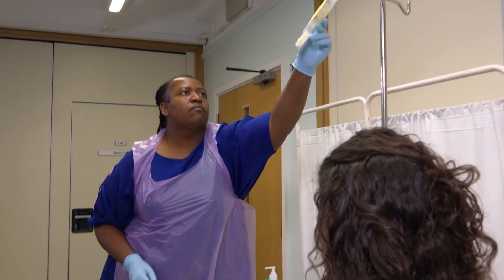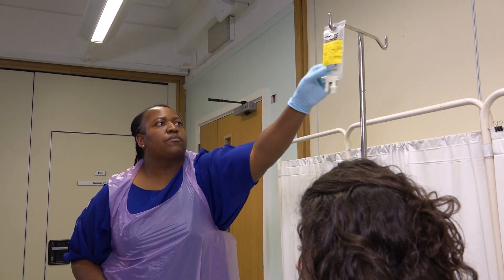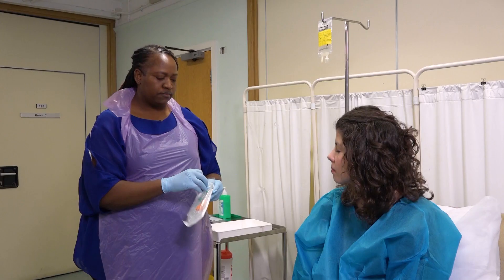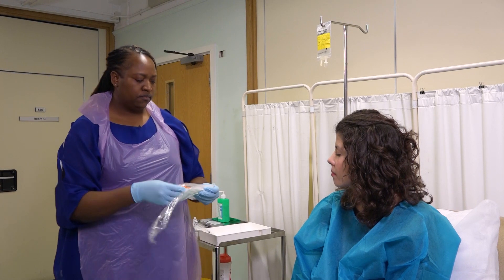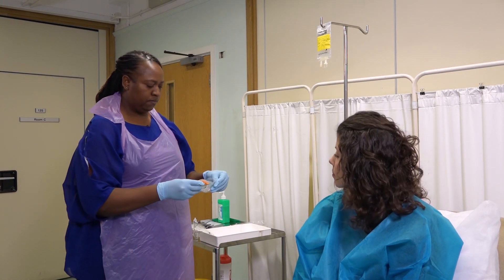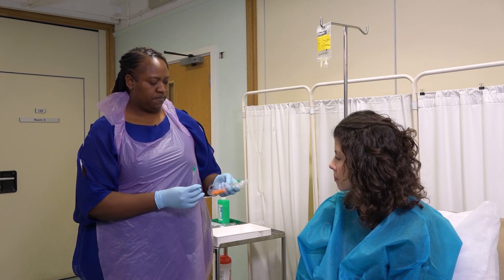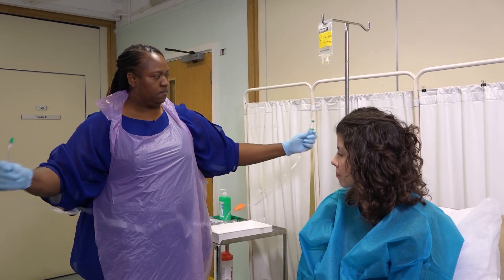Hang it on the drip stand. Now open the fluid administration set, unravel the tube, making sure to keep hold of both ends. These are your key parts that must remain sterile.